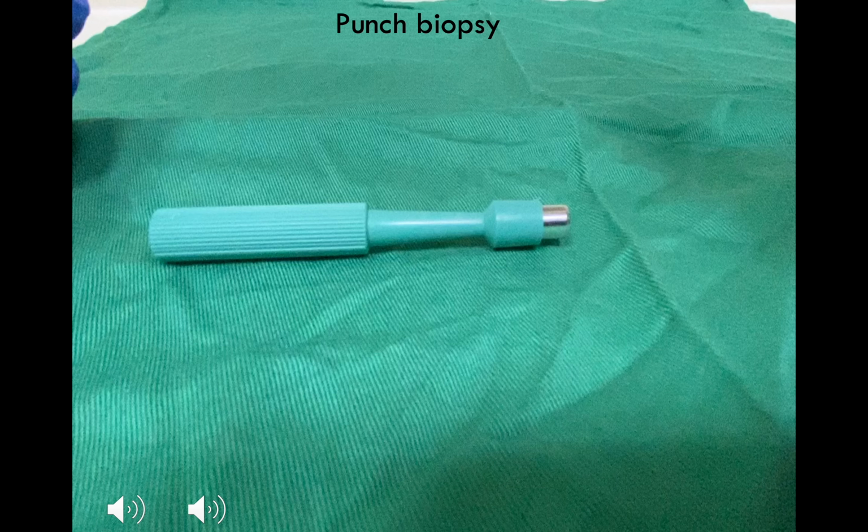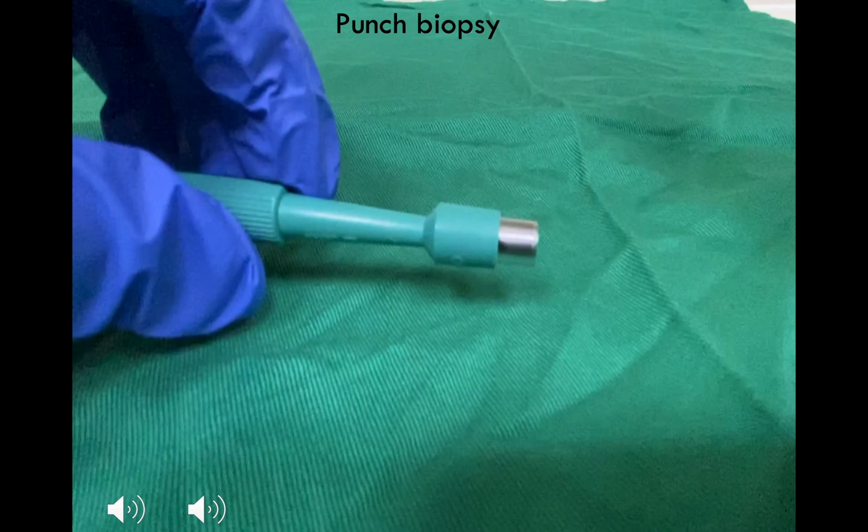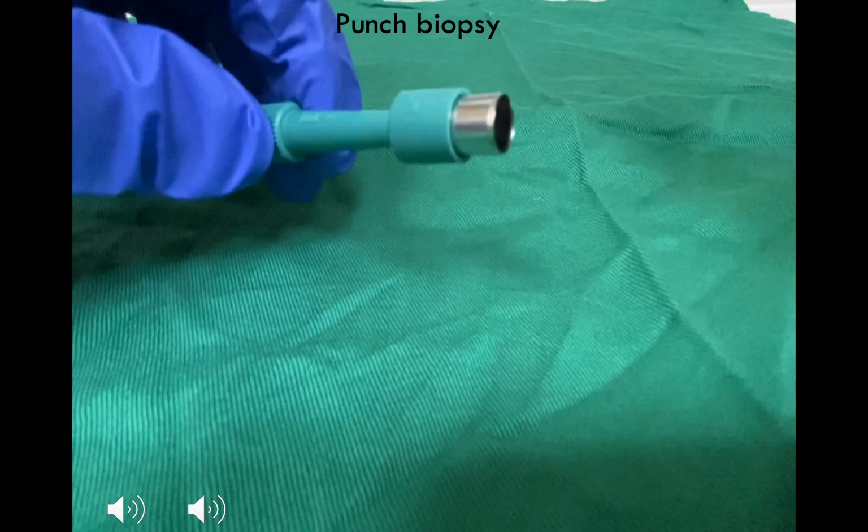This is a disposable punch. Usually it is used in skin biopsy, and in some cases of oral biopsy it can be used as well. We can see there's a circular blade attached to a plastic handle. A punch can range from 1 mm to 8 mm in diameter, and in this case, the punch shown is 6 mm in diameter.